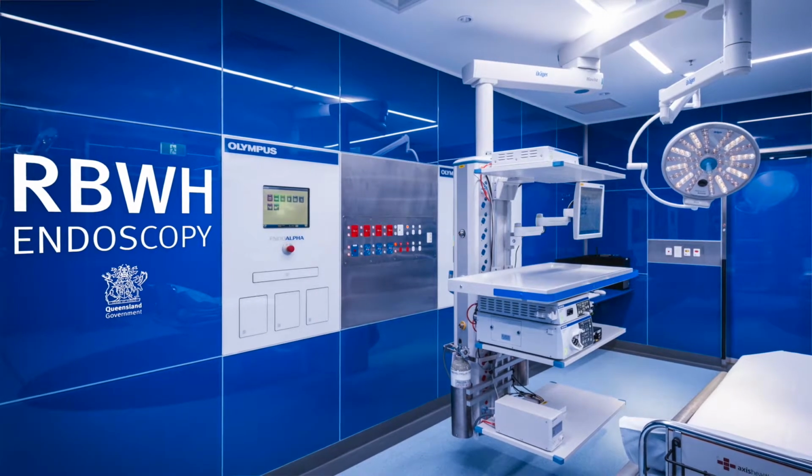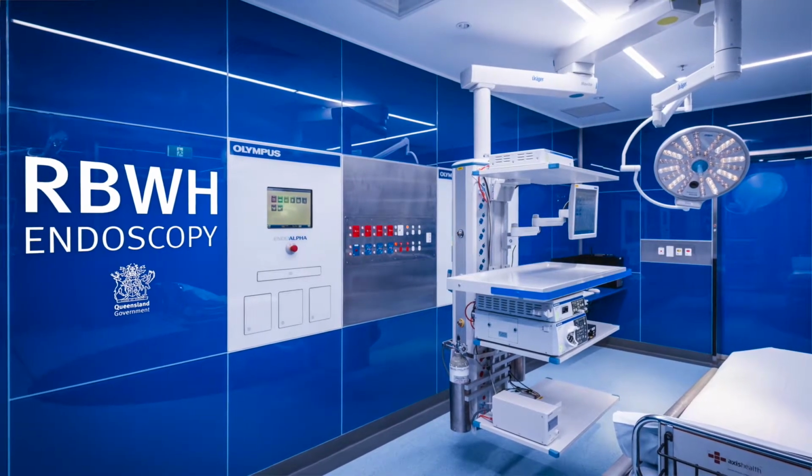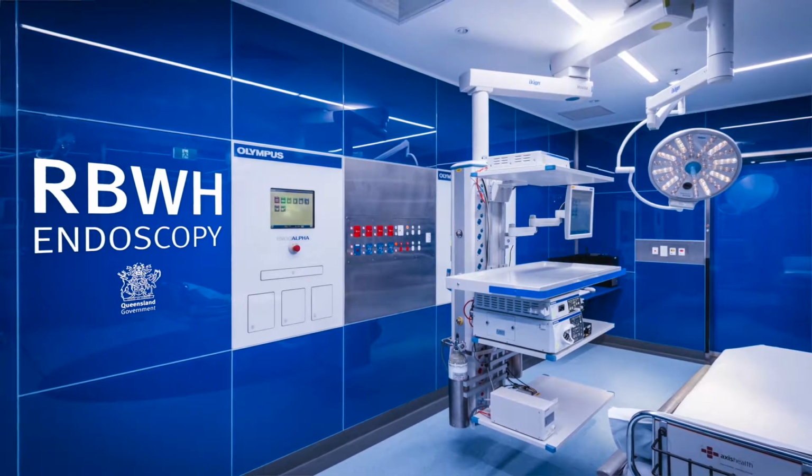I think certainly having lots of cameras around the room is helpful. I think from a patient's perspective, all members of the team, including the anaesthetists, the nurses, have easy access to seeing what's going on endoscopically. And we also have the vital monitors from the anaesthetics machines projected elsewhere in the room as well. So certainly the feedback from the nurses and the anaesthetists is that they're much happier with the environment, they can see what's going on.